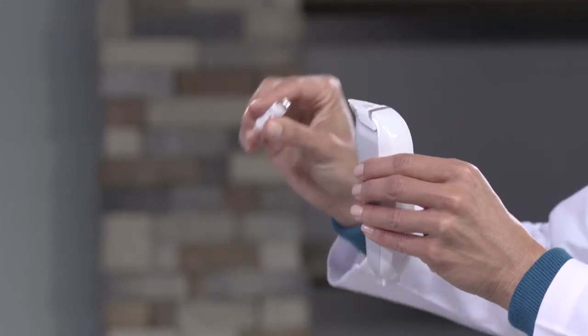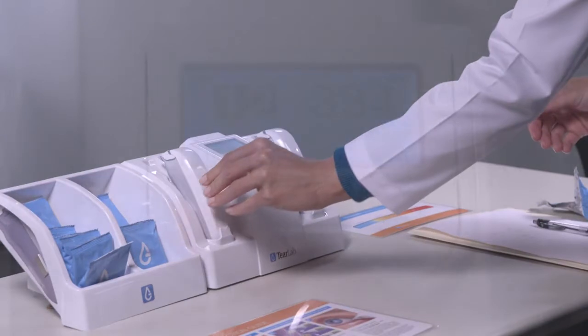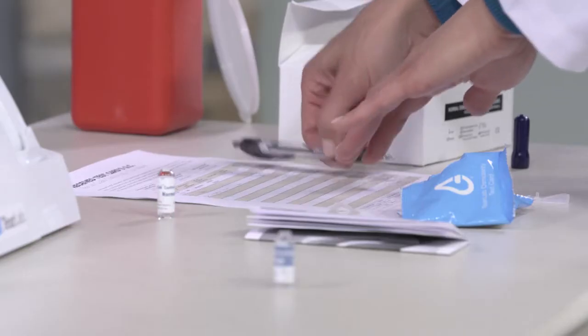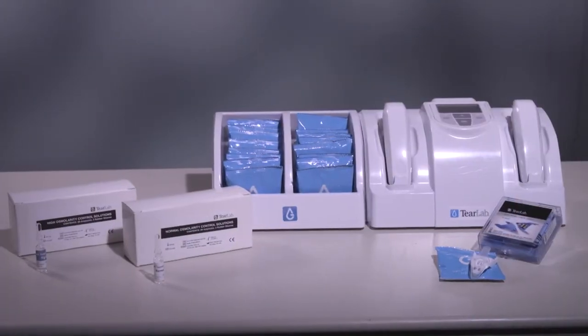Repeat the test using the normal control solution. Once two control solution readings have been verified to be within range and recorded in a quality control log, you have successfully completed the osmolarity control solution test and this lot of test cards is ready for use.